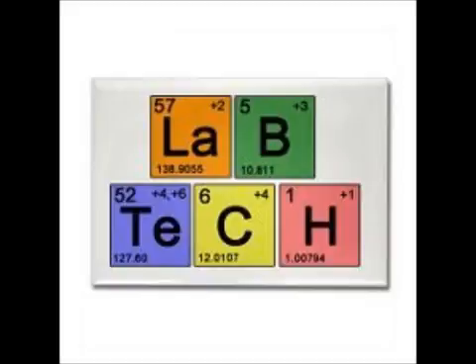This is thrombin time. I'll only have you know a couple things just because of the registry. I don't think you're going to see it in any lab, because one thing I want you to know, underline this sentence: affected by heparin. That's why it is not a very useful test. If your lab does not have something to remove the heparin, it's pointless.